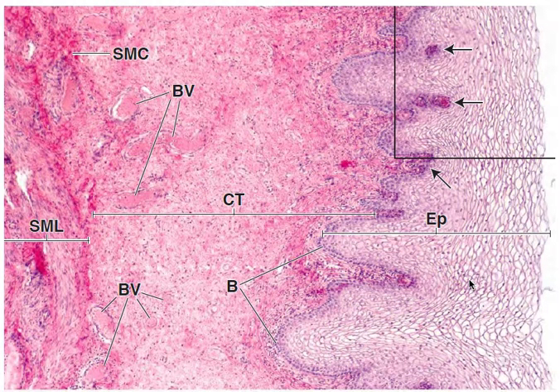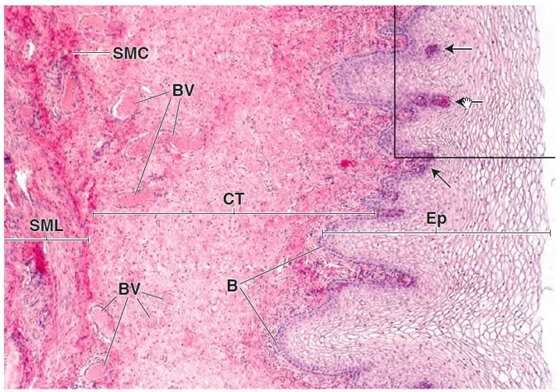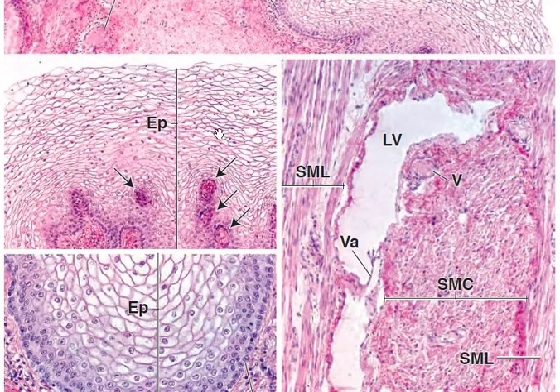Thus, nuclei can be observed throughout the entire thickness of the epithelium, despite the fact that the cytoplasm of most of the cells above the basal layers appears empty. These cells are normally filled with large deposits of glycogen that is lost in the fixation process of these tissues. That's why you don't see it on these stains or in these pictures. The rectangle outlines a portion of the epithelium and connective tissue papillae that is examined at higher magnification below, right here.